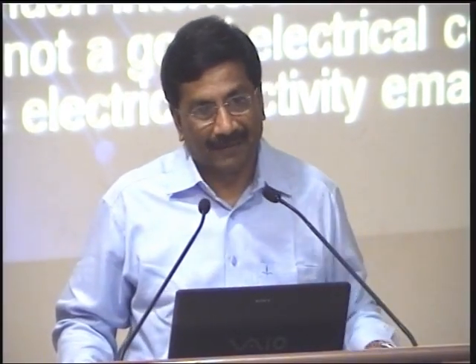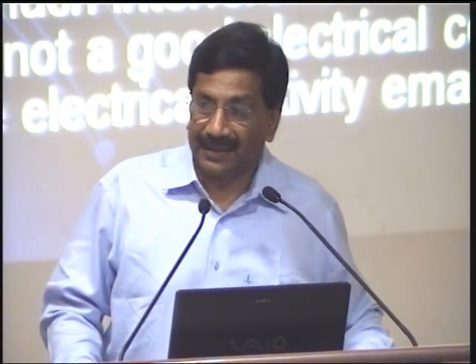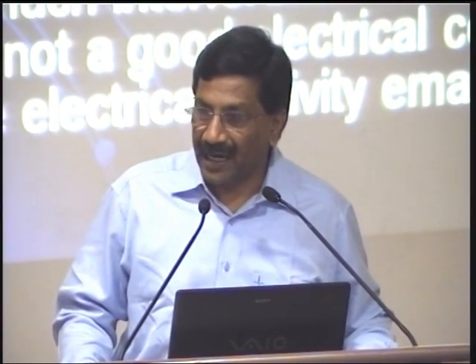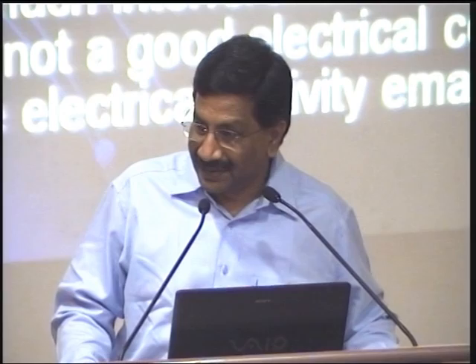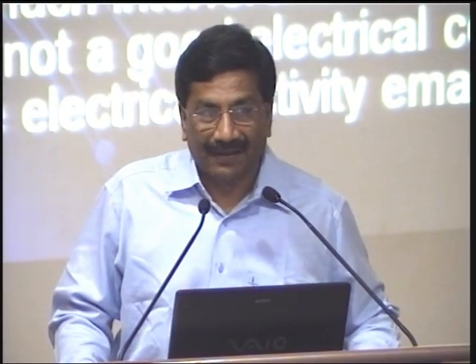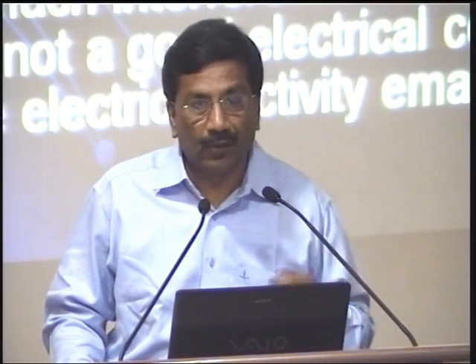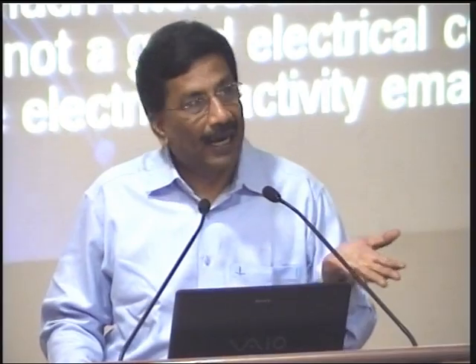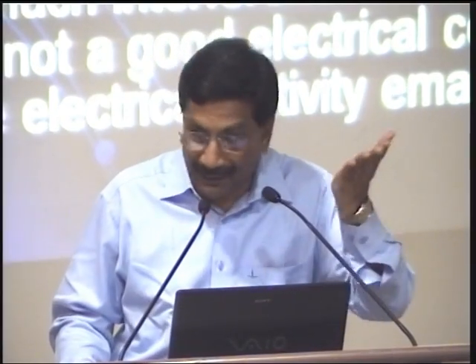What is the purpose? The remarkable property of the heart is that the electricity produced by the heart, from the sinus node, travels all over our body. The electricity travels through the body fluids and blood to the legs. So how do we see the inferior surface? From the legs I look at the inferior surface. I cannot do a laparotomy and see the inferior surface every day, so I look from my legs at what is happening to my inferior surface.